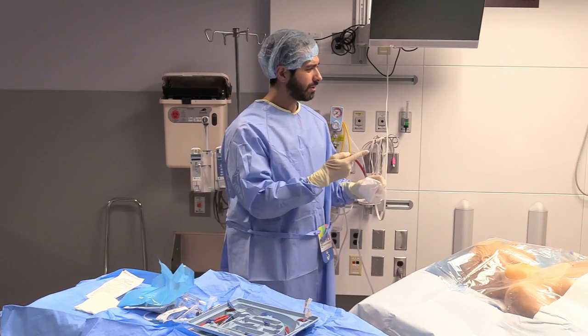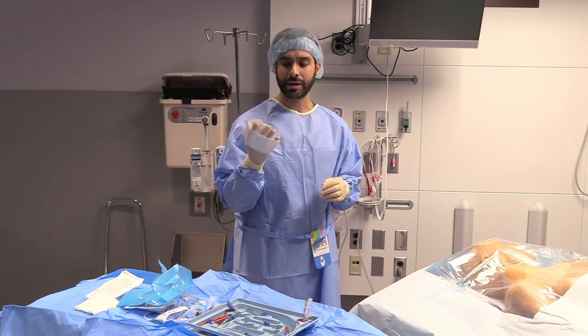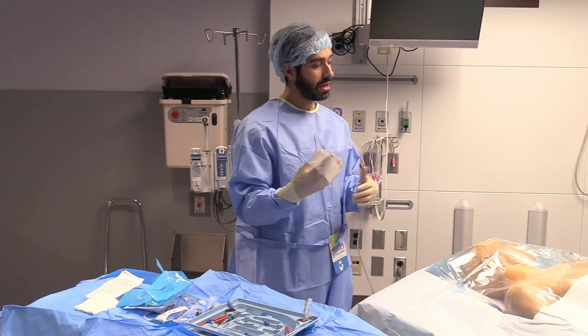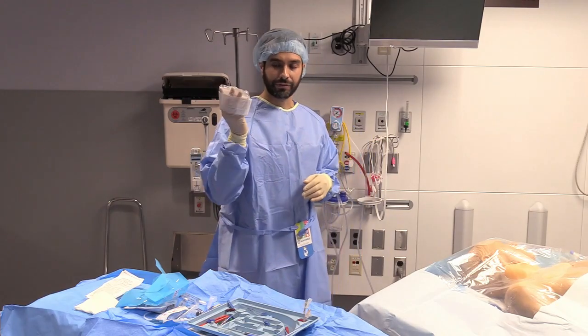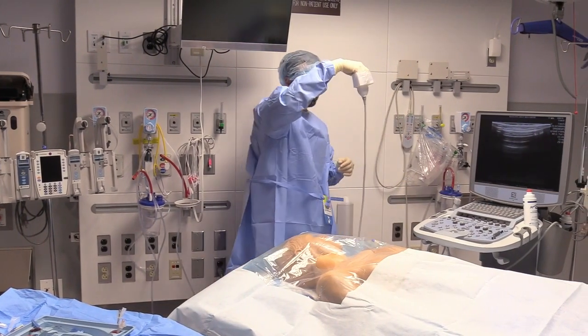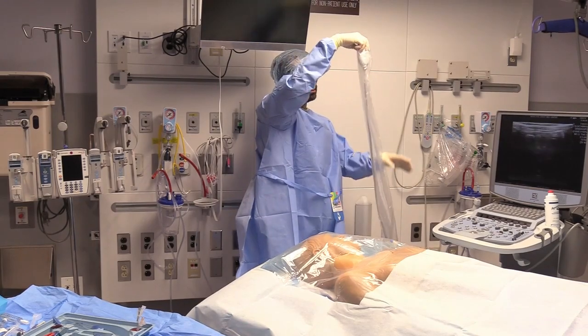Then once you're here, you want to grab so it comes out of the kit like this. You're going to open it up and put your hand inside if you're by yourself. If you have a partner there, they can hand you it and then drop it and pull it this way through the sleeve. But if your hand is inside here, you can literally come over here and then grab the ultrasound this way. Pull it up in the air, and then just pull the sleeve down sterilely.